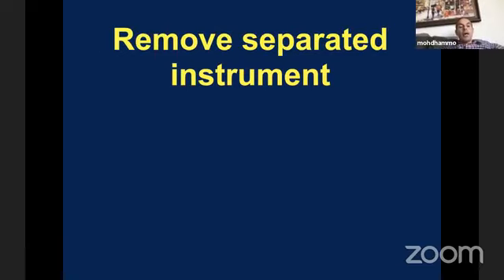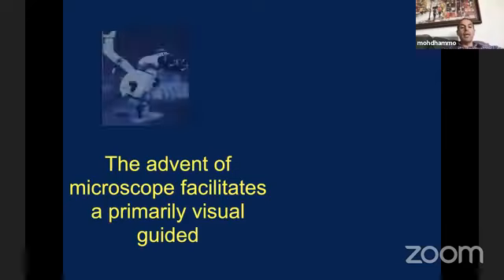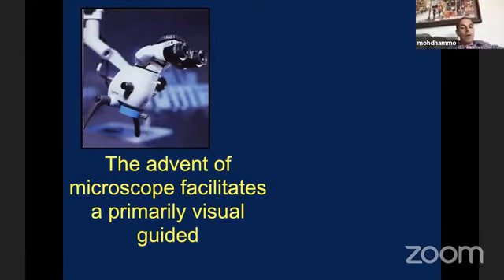Let's talk a minute about removal of separated instruments, and Dr. Talal will go deeply into this subject. But let me remind you, when we talk about removal of separated instruments, we are talking about what we call the microsonic technique. And this micro means we need the microscope, and the advent of the microscope will facilitate primarily visually guided treatment.